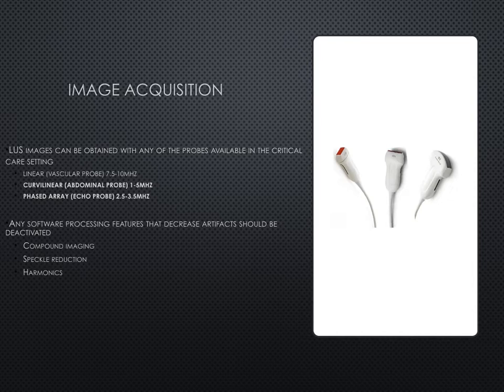Just one thing to note in regards to the basic point of care ultrasound machines that we have. Generally, they're very well suited to imaging the lung itself because we're not having to utilize any of the more advanced techniques that get rid of the artifact patterns.